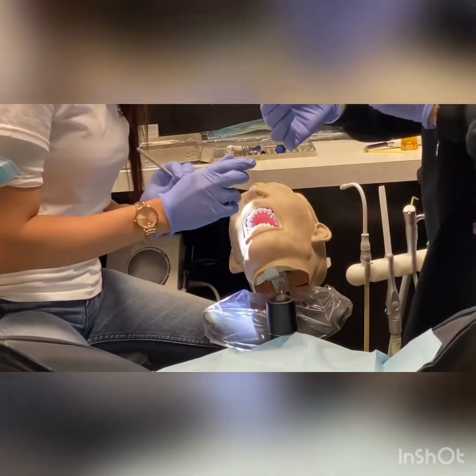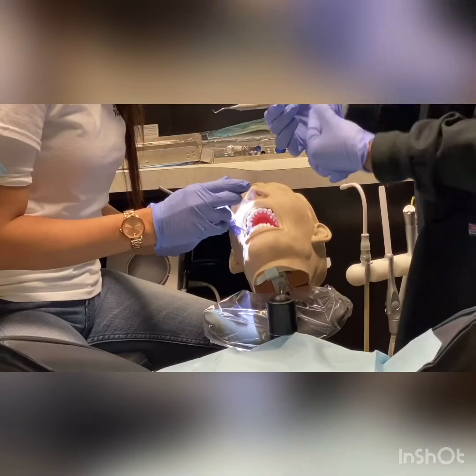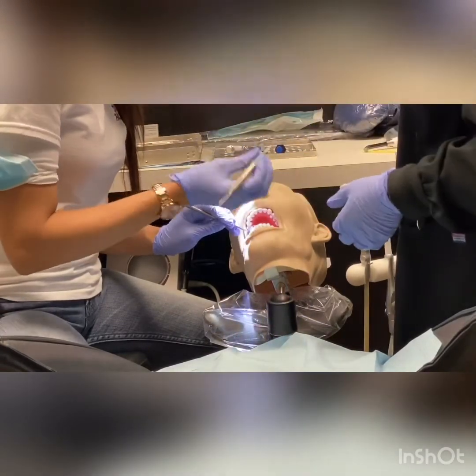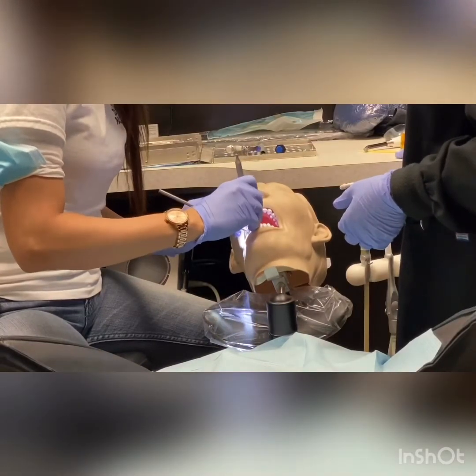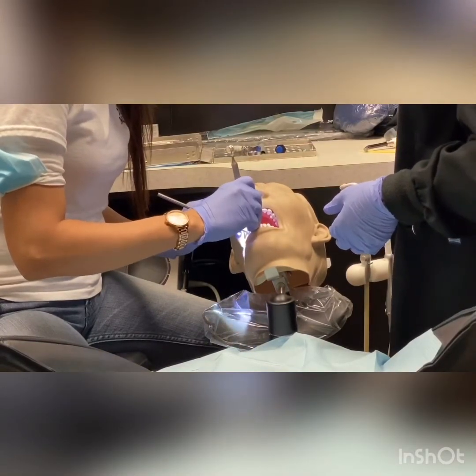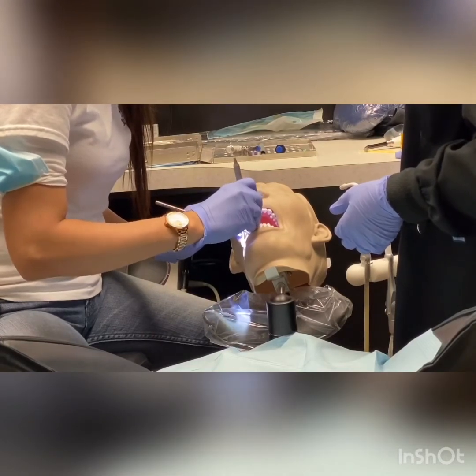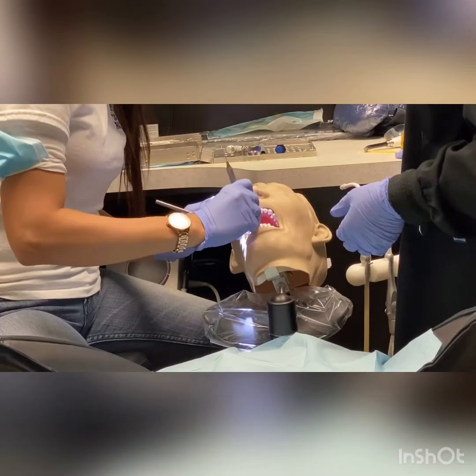Here's your explorer. When you're handing off the instrument, you want to make sure that it's pointing in the direction she's going to use it, and you want to make sure you're holding it at the tip so she has all this space to grab the instrument. I just take it straight from you and go right into the mouth. And I'm good to go. See if I can avoid using that red sauce for now.